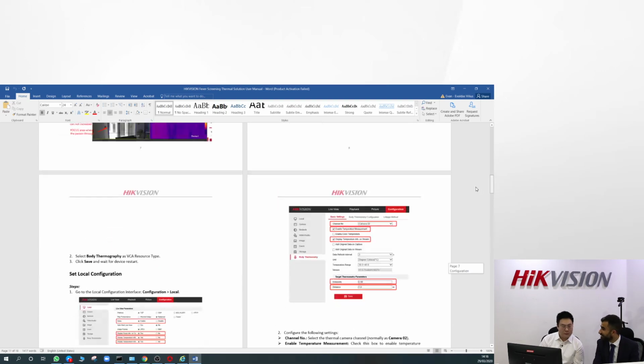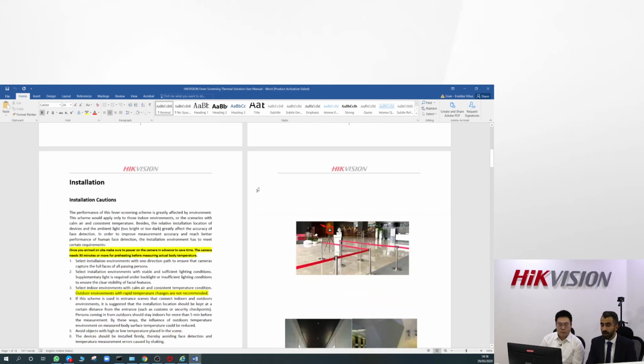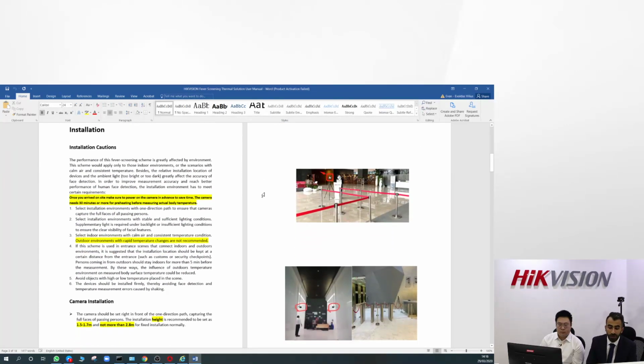Thank you, James. So now, after we get an overview of our product and solution, we'll talk a little bit about the installation and the main points we need to follow before the installation part as well. So I can show this user manual. Mainly there are certain points to be taken care of before you start your installation.